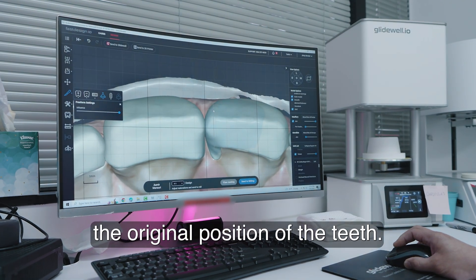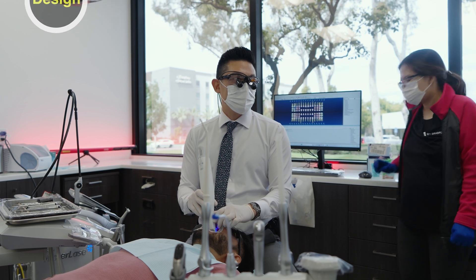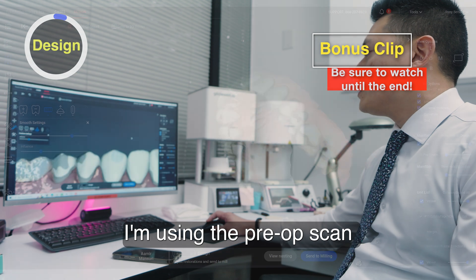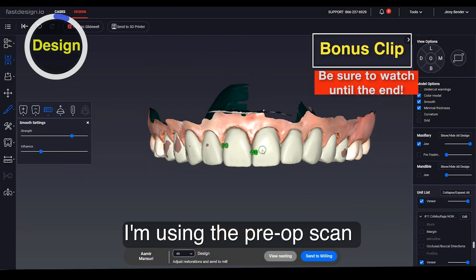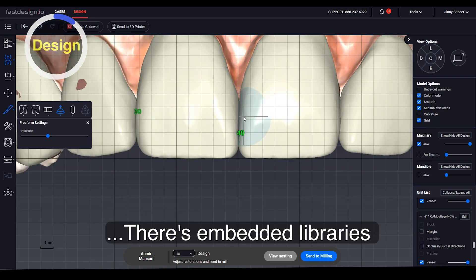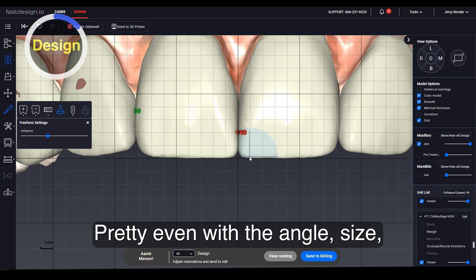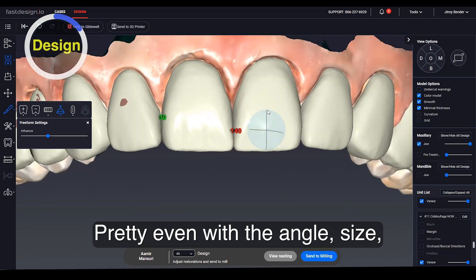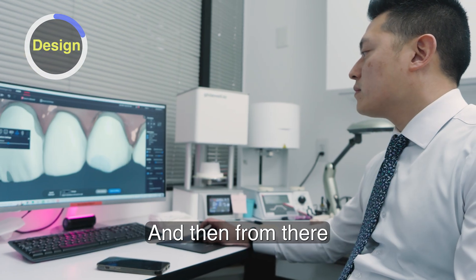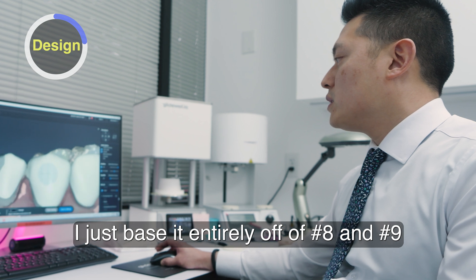We're disguising the original position of the teeth. And then once we transfer that into our Chairside design software, I'm using the pre-op scan of that Chairside mock-up to then position. There are embedded libraries in the design software. I position eight and nine first, pretty even with the angle, size, and position of that mock-up that I created. And then from there, I don't need the position of the laterals — I just base it entirely off of eight and nine.